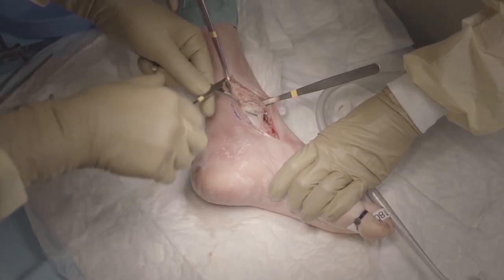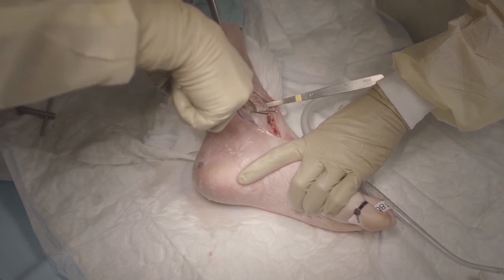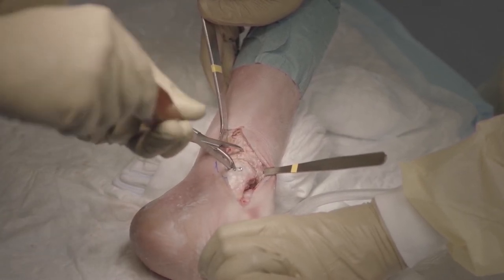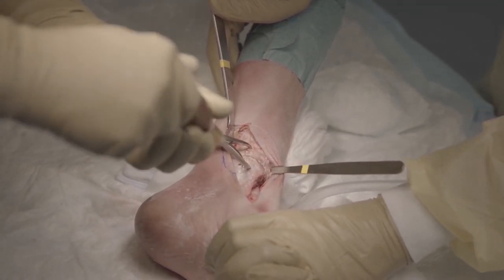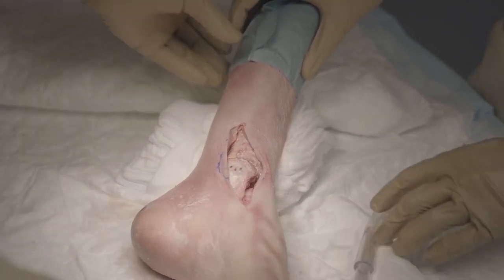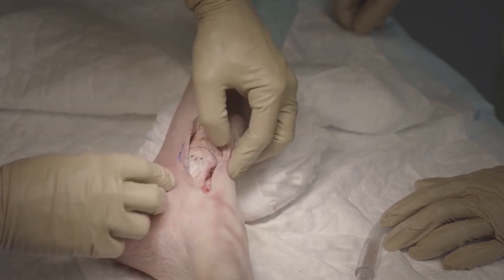When we are happy, we can close the osteotomy with some initial compression. We place 2.5 mm K-wires through the holes to secure the position, and exchange them for two 3.5 mm compression screws — 3.5 mm compression screws with short windings in order to secure the compression. Then we close the subcutaneous layer and finally close the skin with nylon sutures.